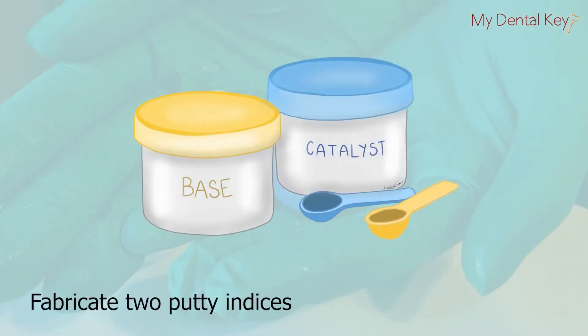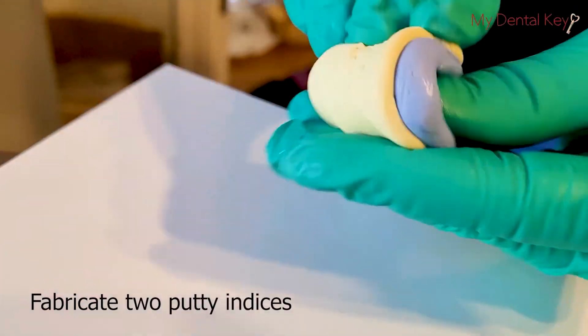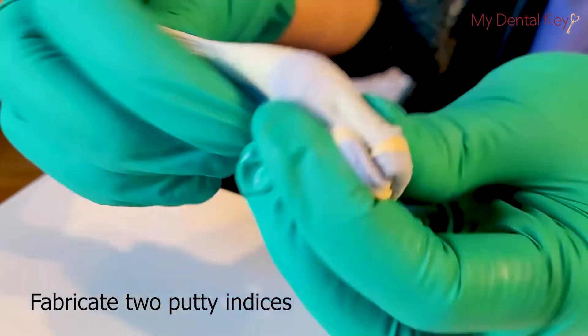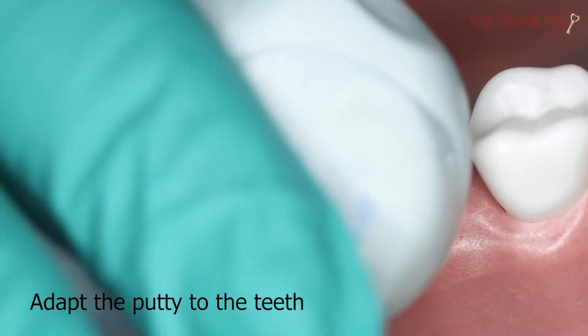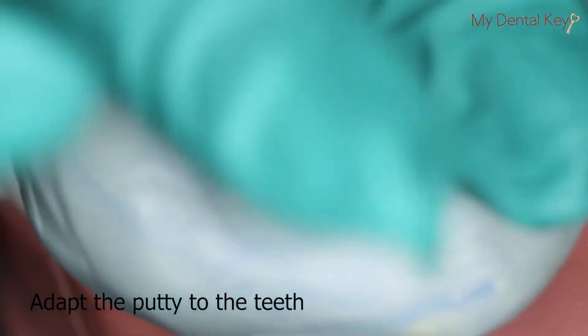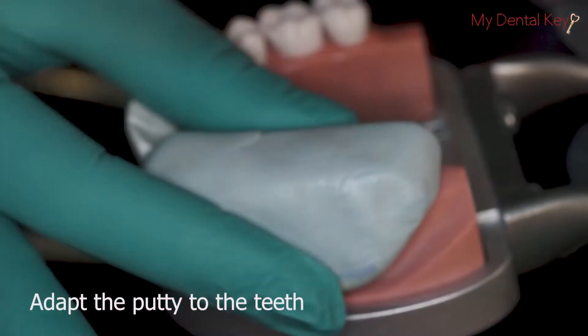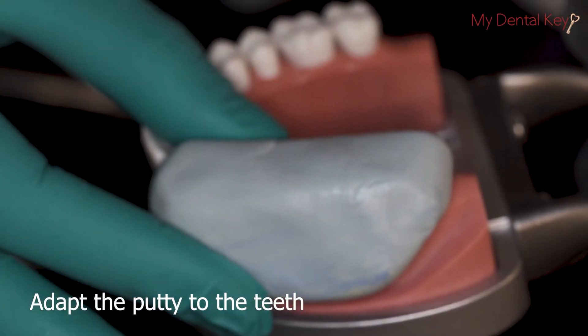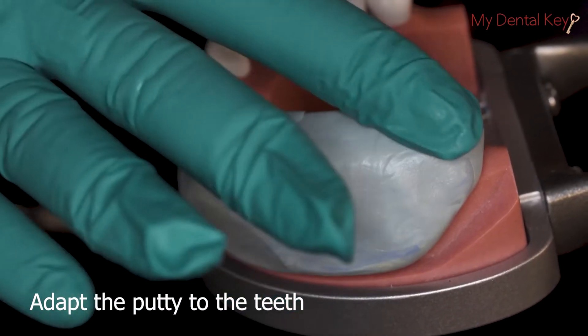To begin, fabricate two putty indices to be used as reduction guides. To fabricate the putty, mix half a scoop of base with half a scoop of accelerator. Knead until the color of the putty is uniform and all streaks have disappeared. Adapt the putty to cover the labial and lingual surfaces of the tooth as well as the corresponding surfaces of at least one adjacent tooth. Allow the putty to polymerize for approximately two minutes or according to the manufacturer's instructions.